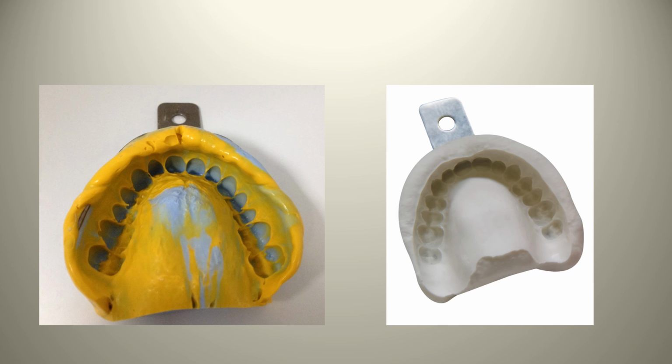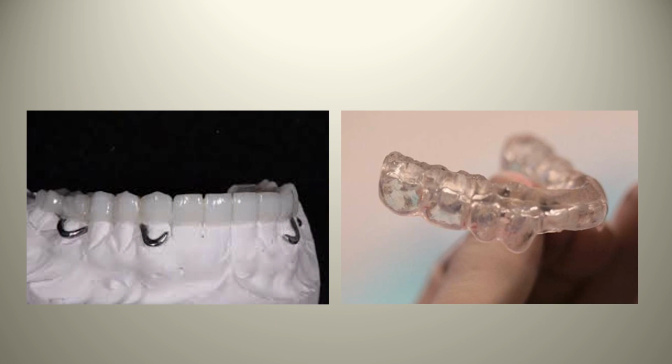And the basic reason I've thrown these out there is that when you're fabricating different things, you have to ask yourself, what is going to give you the most accurate impression for the laboratory. So, if you're just making a sports guard or a night guard or something like that, maybe an alginate impression works. But in the next slide, if you're going to be making something like an orthotic for a trial of a patient in a new vertical dimension, or even your final prosthesis, you probably want to be using something that's a little bit more accurate than alginate, as compared to the picture on the right, just making something like a splint or some sort of surgical stent for a particular case.